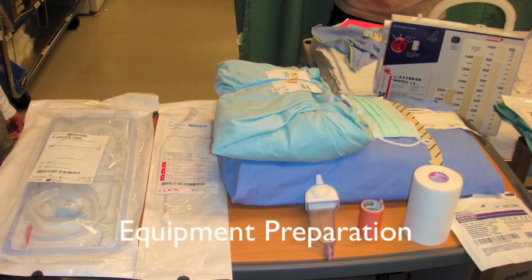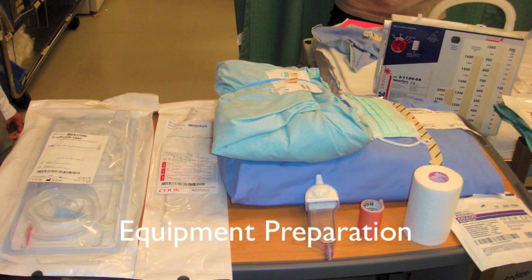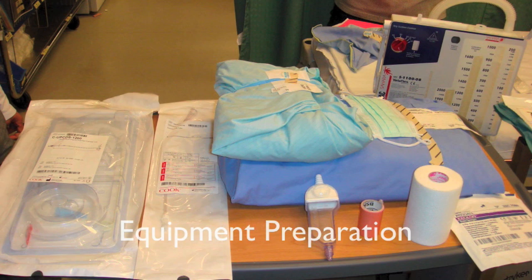Prepare necessary equipment. The complete list of required materials can be found in the document titled Pneumothorax Protocol, Small Bore Pigtail Catheter, Physician Orders.